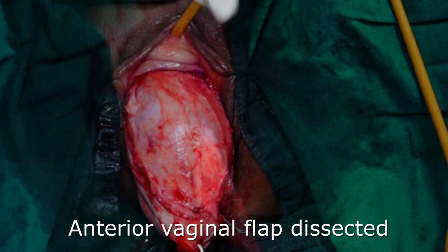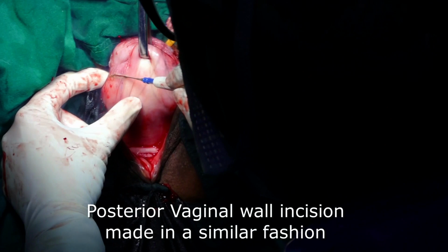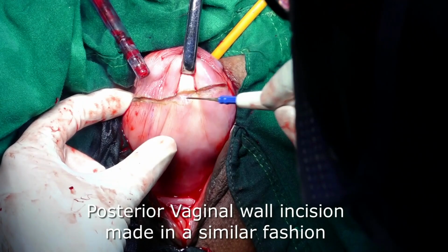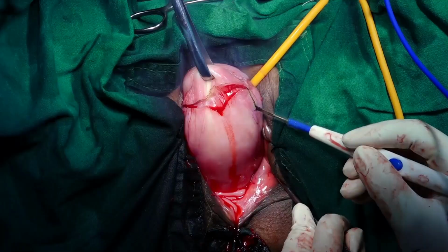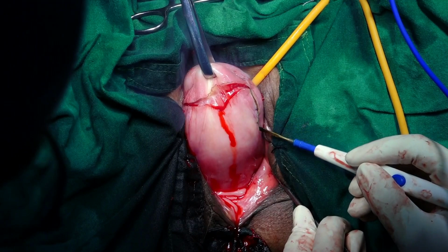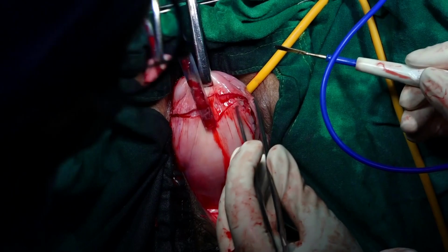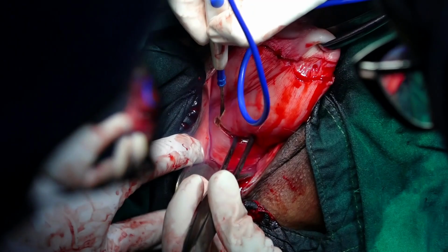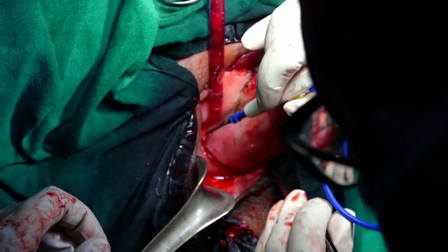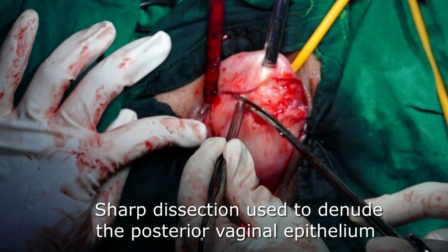It is essential to maintain hemostasis at all times and so the bleeders are cauterized. Posteriorly, the outlined areas have lightened, but as mentioned earlier, the rectangular flap is raised even posteriorly. Posterior dissection is also done using scissors, similar to what was done anteriorly.